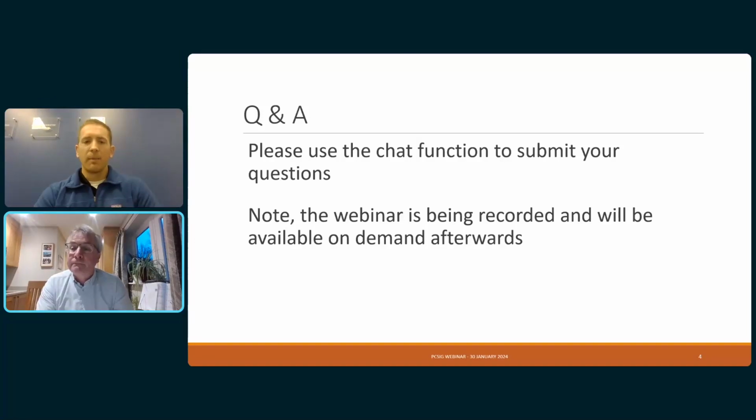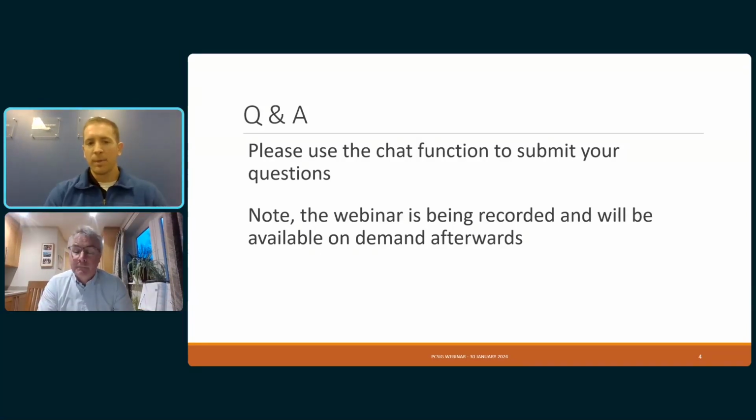Yeah, I think the drying component includes the shipment part, because the device will have that label pulled off and then be placed under desiccation, and then will be drying. It's not like it needs to be set out at the patient's house for 24 hours before shipment. They're going to collect, remove the label, and then that is going to dry for at least 24 hours. Most of the time, it might be for a month before they receive the samples and things like that. So I think it's realistic.